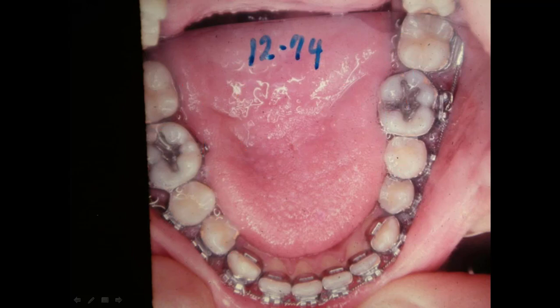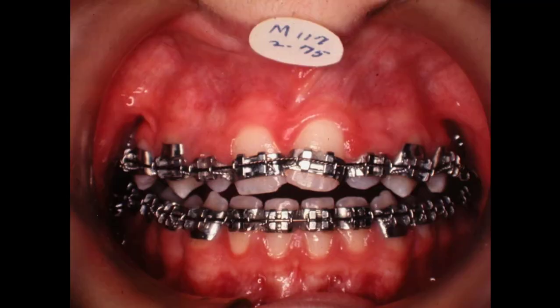Now this lower arch was already wide — probably from function, and I think mouth breathing. But she didn't have any increase in vertical dimension of the face. Here we are in 2 of 75, and we've got this lined up pretty good. We brought these teeth back together — there was a big gap in between here.